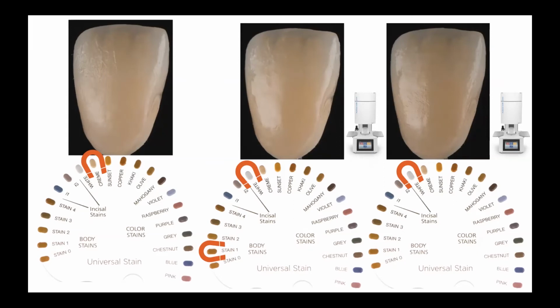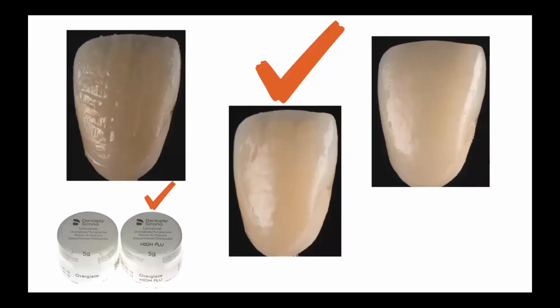And after providing the firing, fixing that applied stain, I keep on with applying white stain. I was inspired to use this technique by an article of Paolo Cana. Once I met it in the magazine Quintessence and tried to use his principles of 3D painting. They're very effective. And I need to finalize my restoration with the help of glaze.